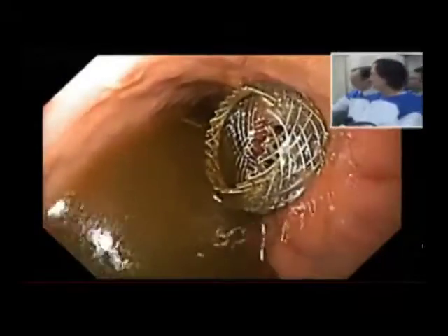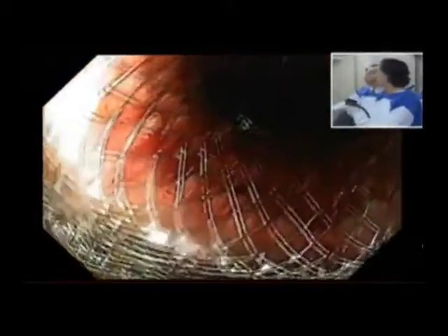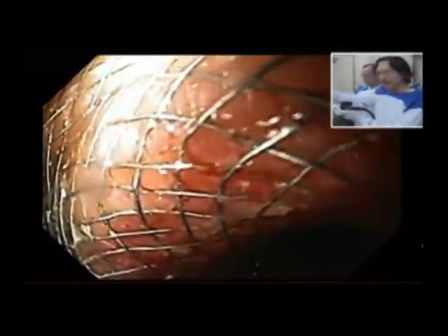Necrosectomy can be performed through the stent. Thus, the stent serves not only for drainage, but also as a port or a conduit to enable access to lumens outside of the gastrointestinal tract and to extend the reach of interventional endoscopy to these extraintestinal structures.